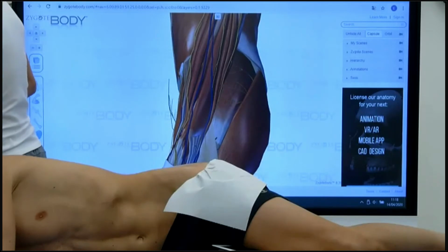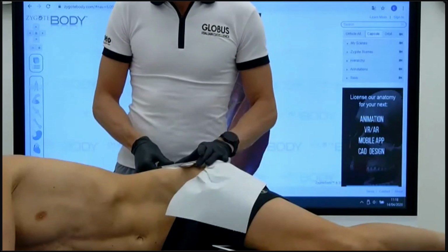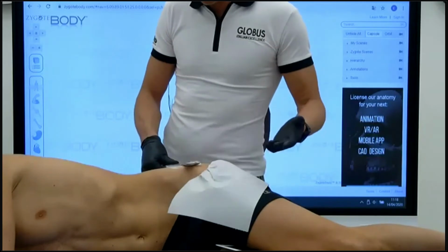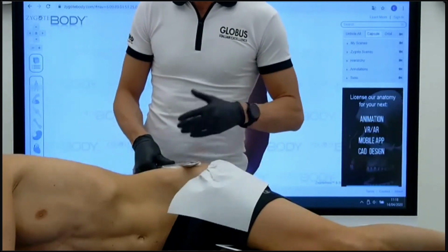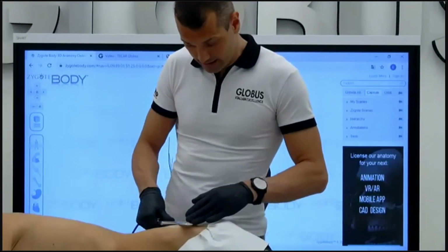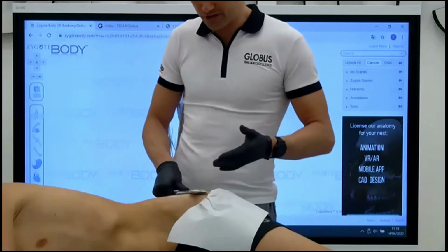So, I select the fascia modality. I stay here with a flat positioning. I stay fixed here. I ask Damiano if he perceives some warming sensation, like with a normal resistive tool, without any scraping technique, just waiting for warming in this anatomical region. From zero to ten, how much? 6. Okay, he's starting to perceive a 6.